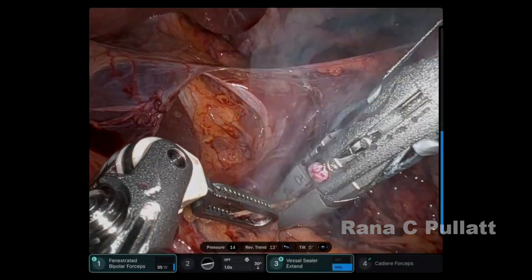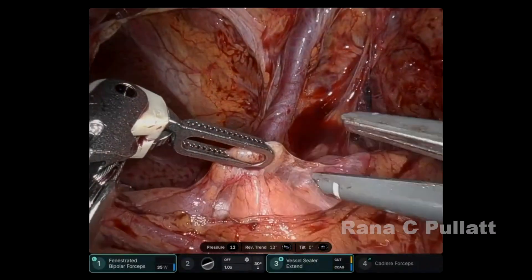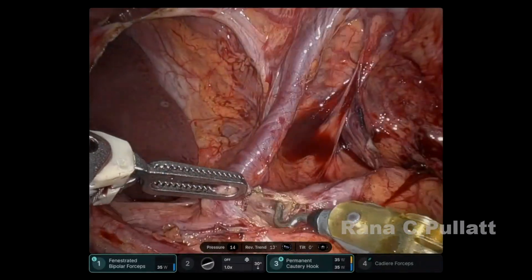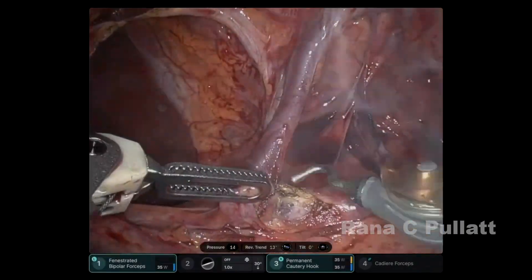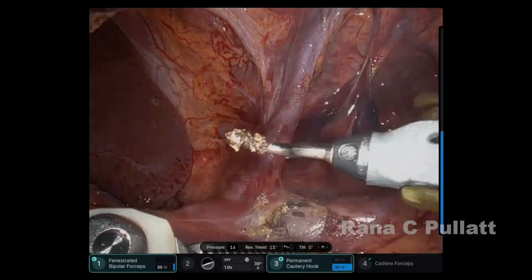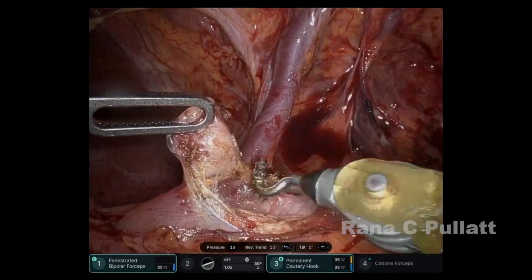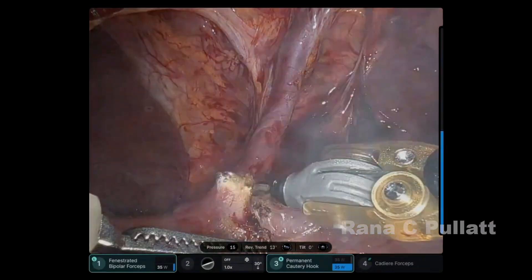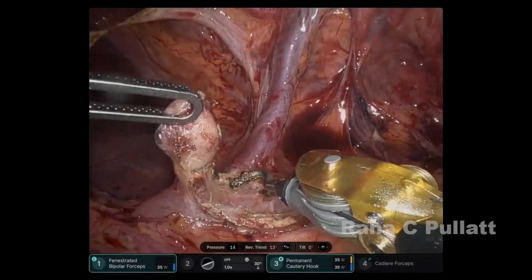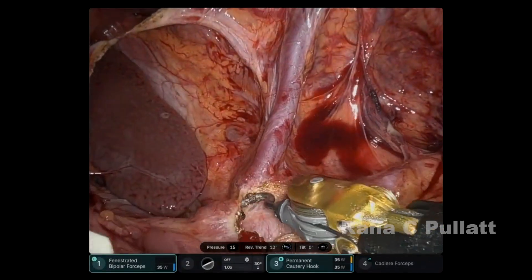The pars flaccida has been opened. The lymph node overlying the hepatic artery is then dissected away to expose the common hepatic artery junction with the splenic artery. Once this is exposed, the left gastric vein is then dissected. The common hepatic artery is now in view and the splenic artery confluence can also be seen.